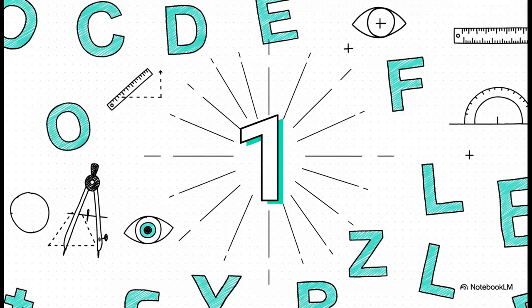And think about this. To actually see that whole 5 arc-minute letter, your eye has to be able to pick out the critical details inside it, like the little white spaces between the arms of an E or the gap in a C. And those details, they subtend just 1 minute of arc. This tiny little angular measurement, it's the fundamental building block of the entire 20/20 system.